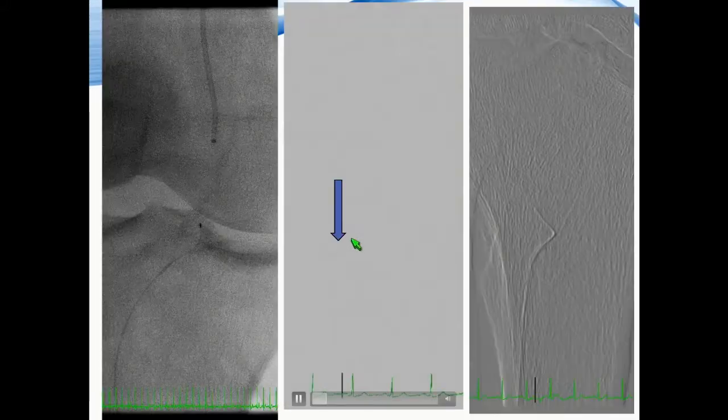and that's not the point of this presentation, but I want to highlight: what do you do when you go through these challenging cases? What are your choices? So we had to get retrograde access, but even that was not easy because we had done so much damage from the top. And we kept going to the wrong place.